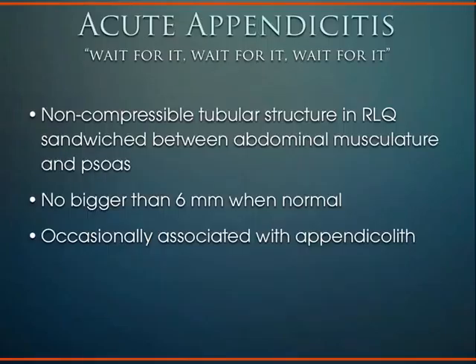And finally, appendicitis, one of the most challenging things you can do with an ultrasound probe, in my opinion, but also one of the most rewarding and important things that you can do with an ultrasound probe. The trick here is to just be really good with ultrasound and develop these skills over time and practice.